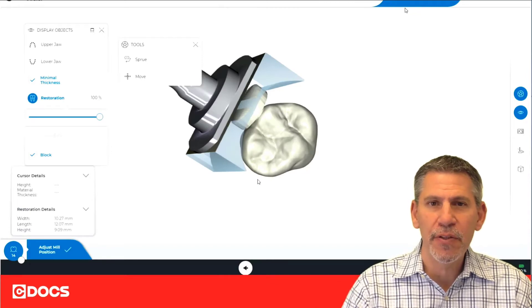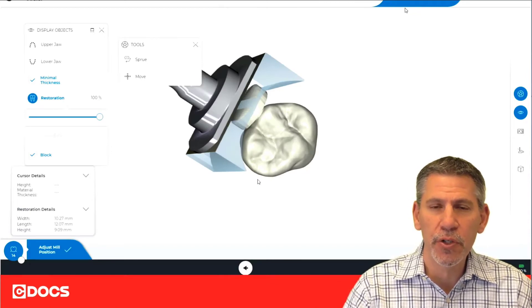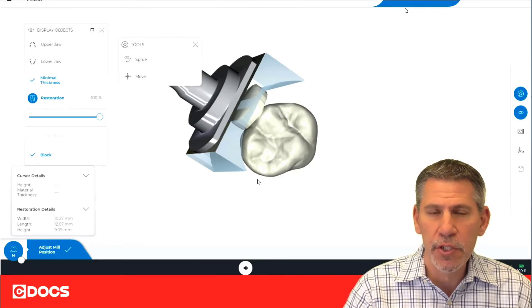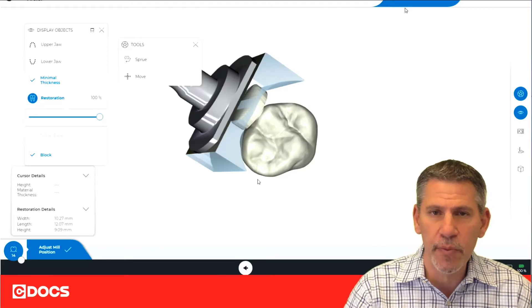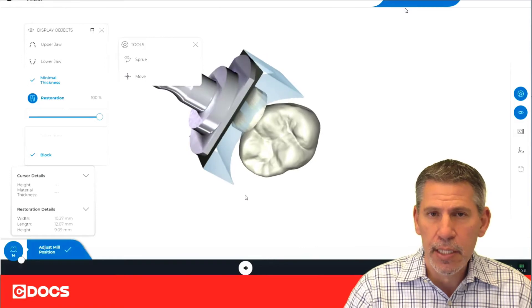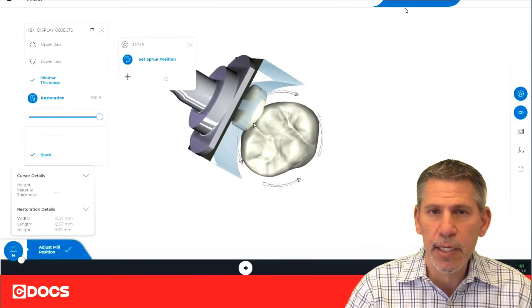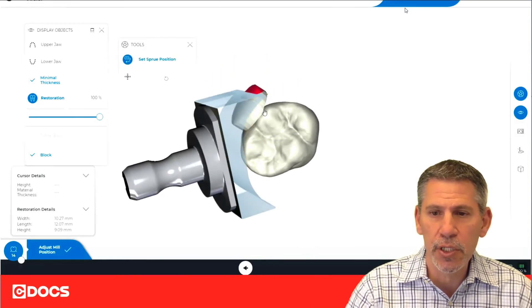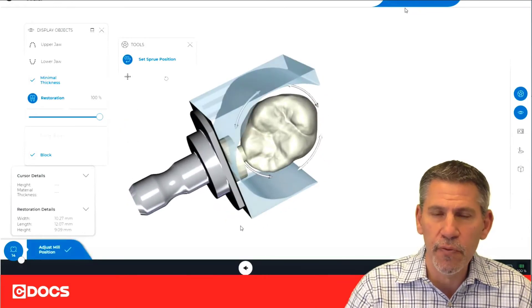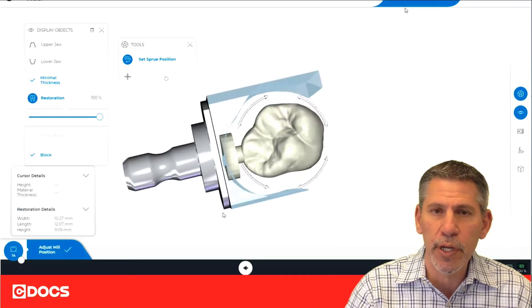I'd like to talk about an issue that sometimes occurs when milling zirconia. This can be particularly a problem with katana because it's just a harder restoration. What we sometimes find is that during the milling process, the restoration will actually fracture away from the block. A potential issue for this is if the sprue is placed on a line angle — right at the junction of the buccal surface and the occlusal surface — that can create too much shear force and the restoration can potentially break off.